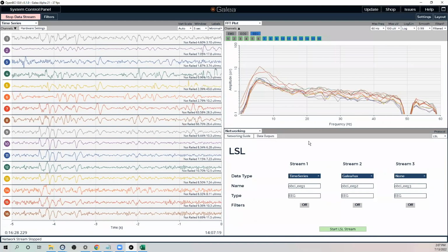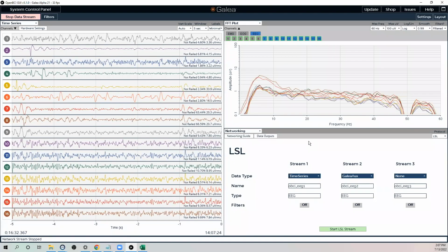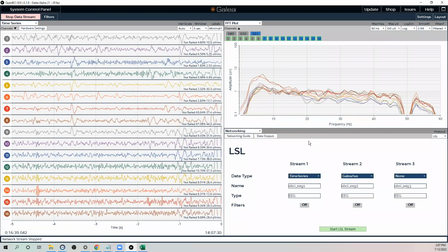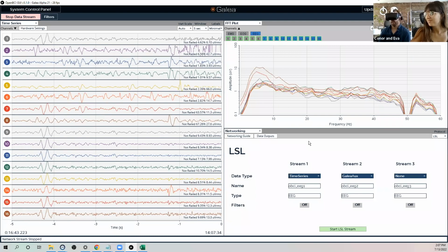Cool. Another one, if Galea were used to play test VR games, what metrics would be worthwhile or interesting to track as a developer? This is a big question.